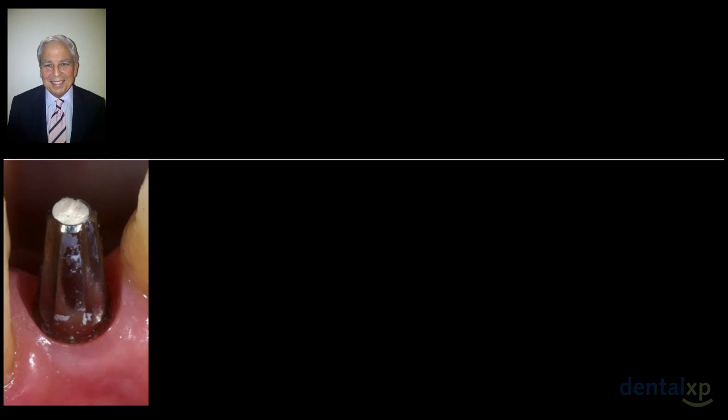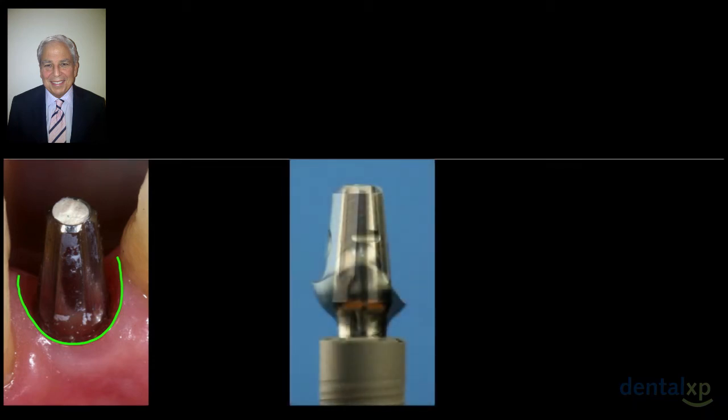We don't have a lot of room, so in this particular situation, we chose a convergent abutment. Now the green is the biologic envelope that Bill was talking about. You can see when I overlap the anatomic abutment, which is divergent, with the other abutment, which is convergent, take a look at how much more room that divergency is taking up.